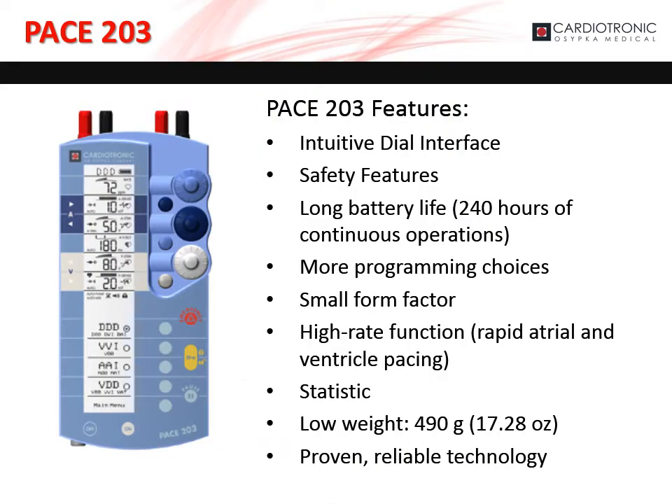The PACE 203 is our dual chamber external pacemaker. It provides a vast array of pacing modes with an intuitive dial interface that allows the user to easily change sensing and stimulation settings in both chambers. The PACE 203 is capable of providing rapid atrial and ventricular pacing along with in-depth statistics.